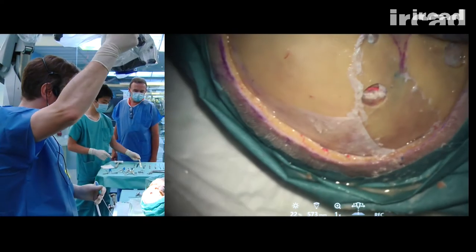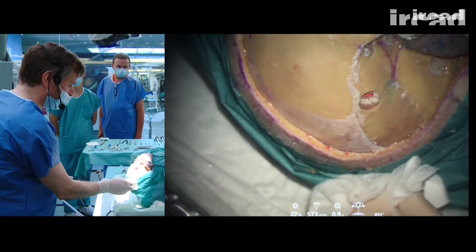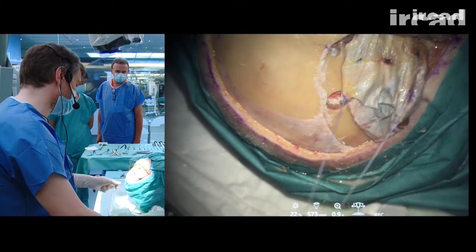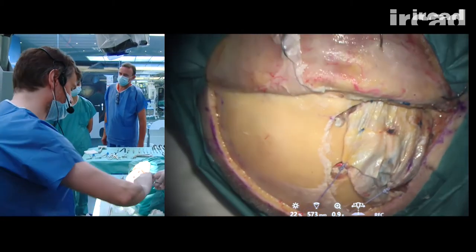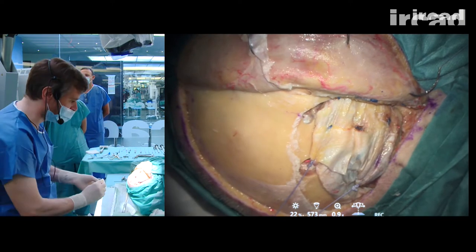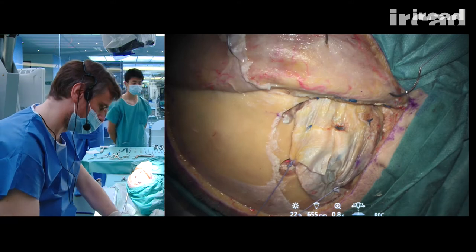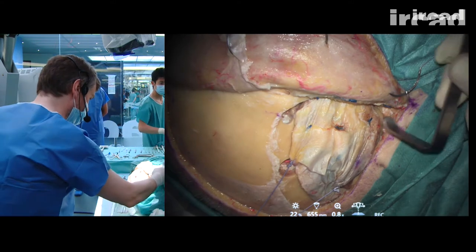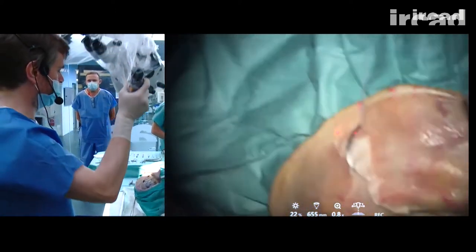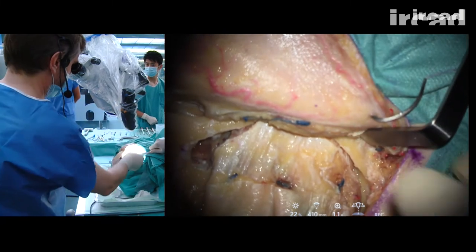Now we will start with the bone cut. The burr holes are done. First bone cut to be done is the one on the zygomatic arch. So we need to cut the zygoma.